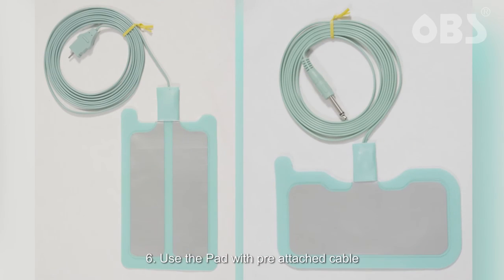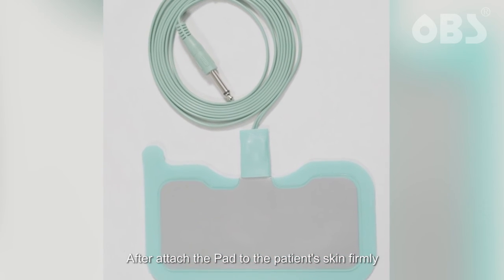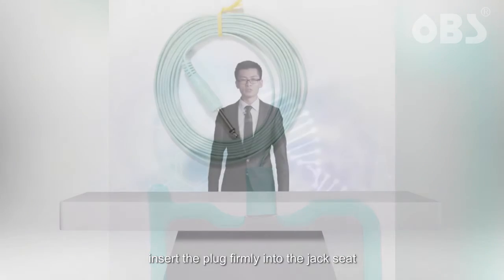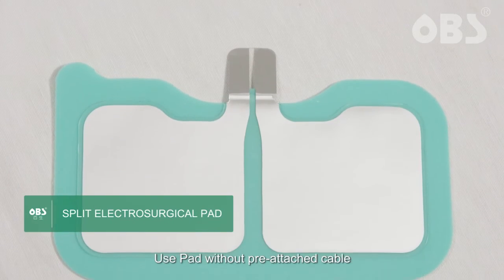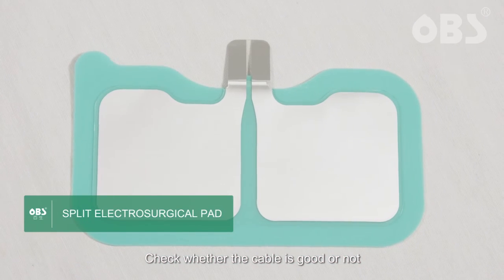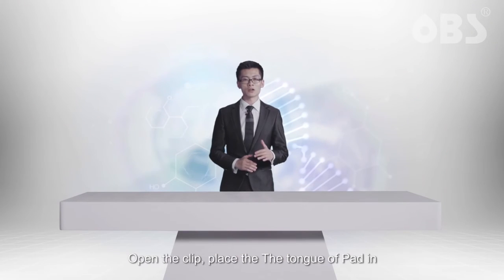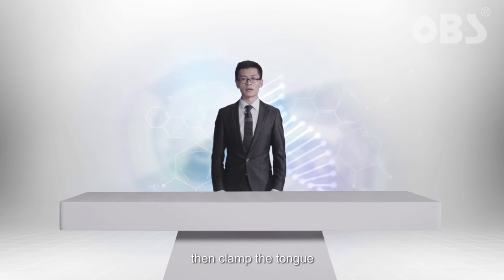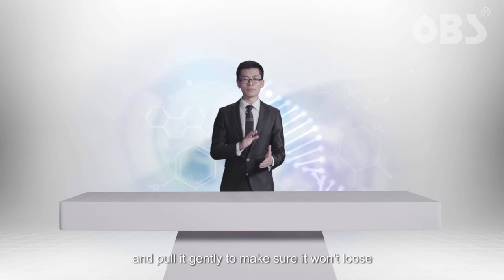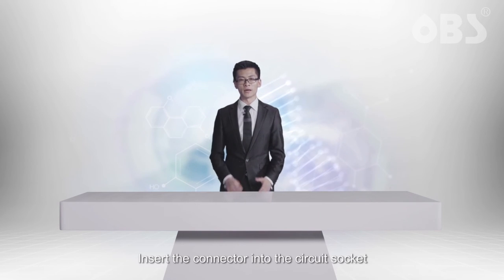6. Use the pad with pre-attached cable. After attaching the pad to the patient's skin firmly, insert the plug firmly into the jack seat. Use the pad without pre-attached cable: check whether the cable is good or not, and attach the pad to the patient's skin firmly. Open the clip, place the tongue of the pad in, then clamp the tongue, and pull it gently to make sure it won't loosen. Insert the connector into the circuit socket.